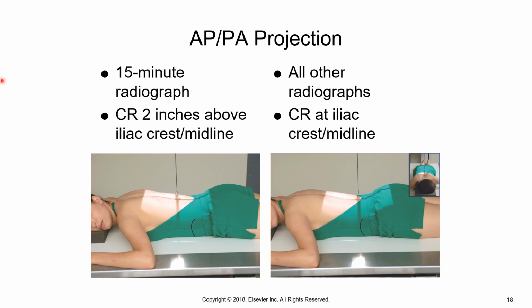The SID is 40 inches. You are on a 14 by 17 portrait. If your patient was hypersthenic, it is possible you would do 2 images landscape. Your kVp range is 110 to 125 for single, 90 to 100 for double, and or water soluble.